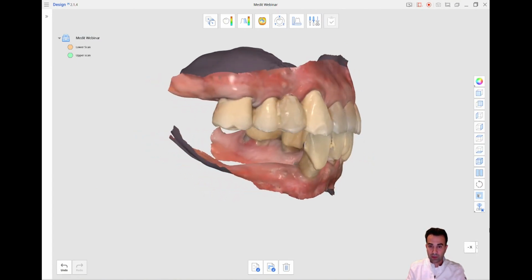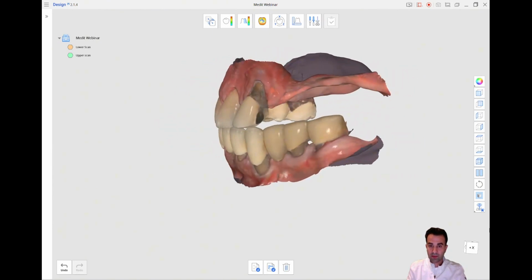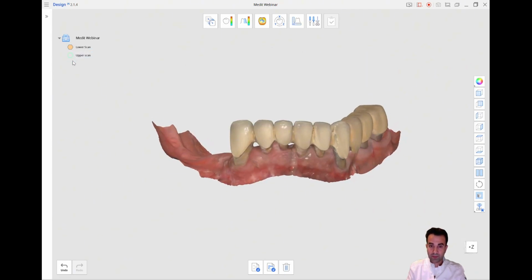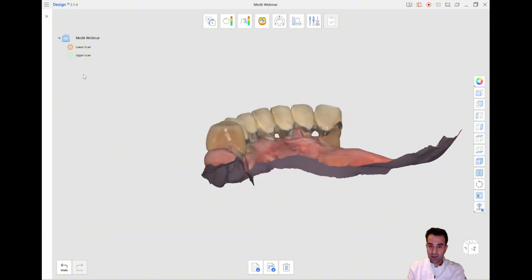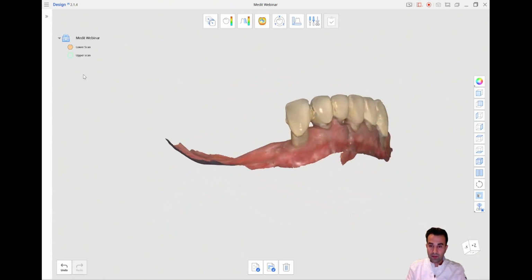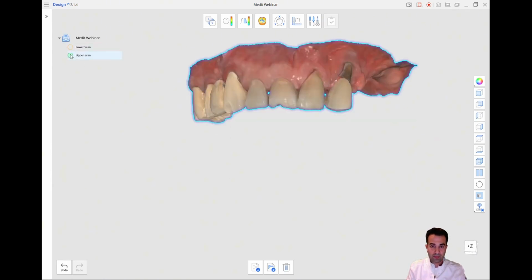We have terminal dentition, multiple missing teeth, severe bone loss, multiple teeth associated with infection, failed root canal treatments, mobility, and caries, a few bridges, and fused crowns.